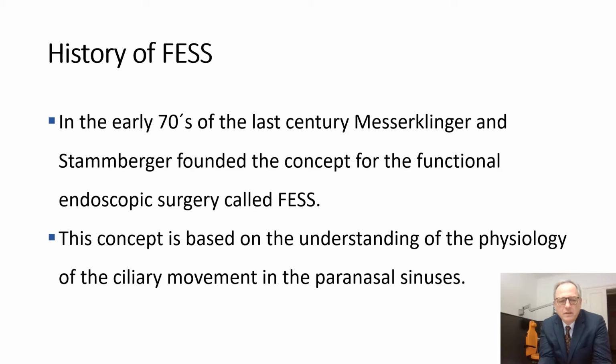Now to the history of FESS, of this Austrian endoscopic founding. In the early 70s of the last century, Messerklinger and Stammberger founded the concept for the functional endoscopic sinus surgery, now called worldwide FESS. This concept was based on the understanding of the physiology only of the ciliary movement in the paranasal sinuses.